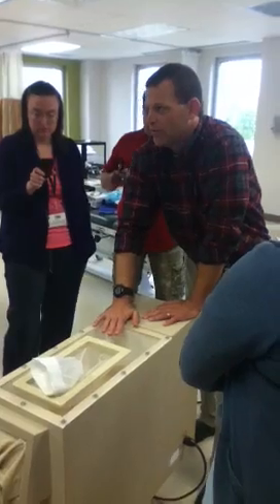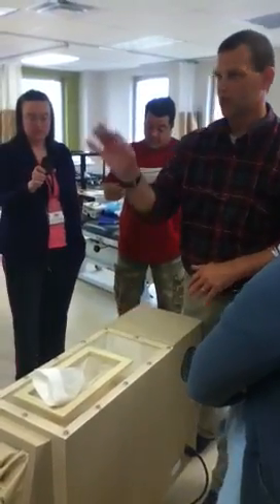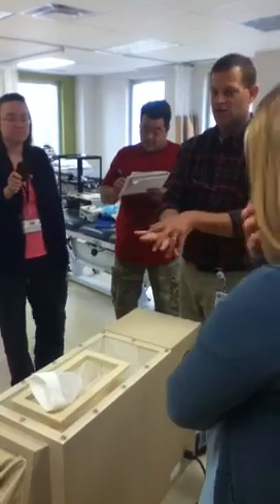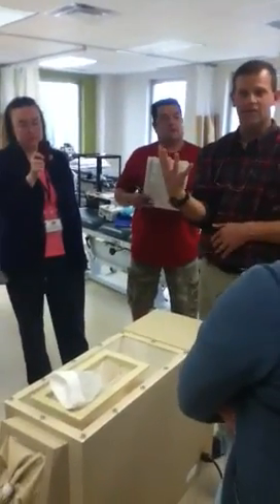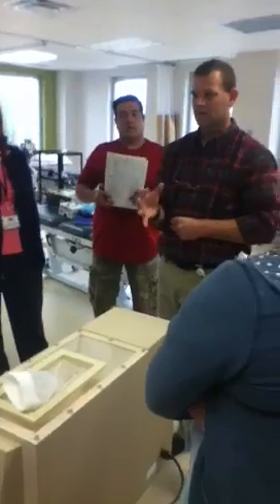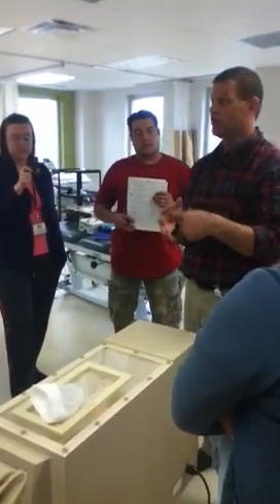So what's the advantage of this over maybe paraffin? How many of you guys have ever stuck your hands in the paraffin? So now you've got to hold your hand still. You dip it, you dip it, you dip it. Now you've got this glove of wax on your hand. You're just going to hold it still. So it's an advantage over heat.